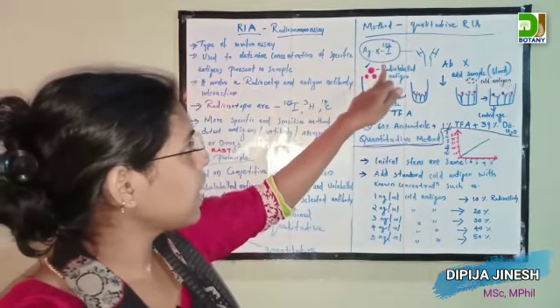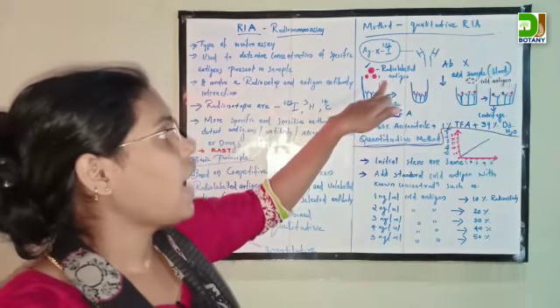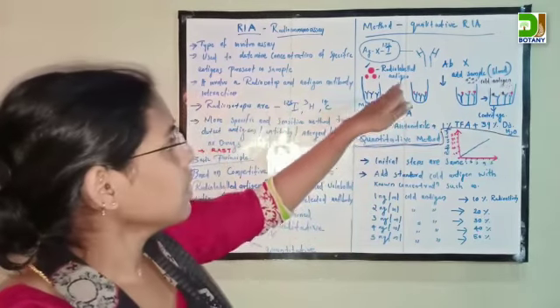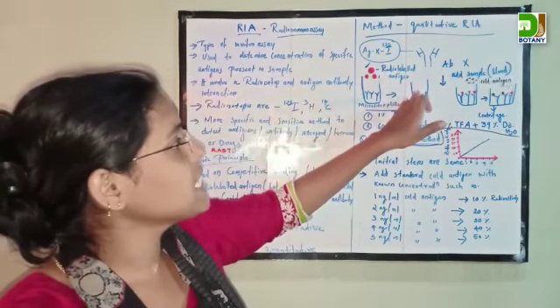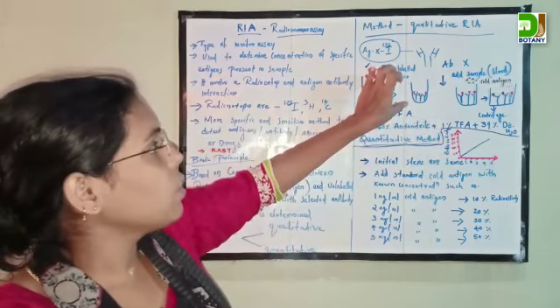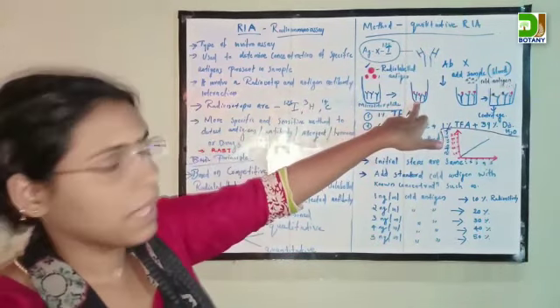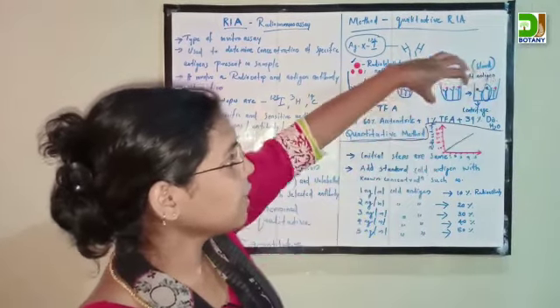The radiolabeled antigen is first put into the antibody taken in the microtiter plate. In the second step, the radiolabeled antigens bind with their specific antibodies present in the microtiter plate, so the plate contains only the complex.